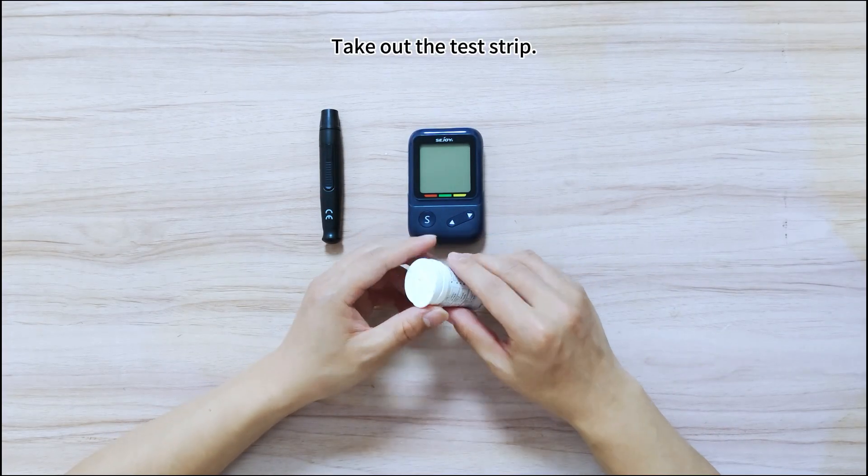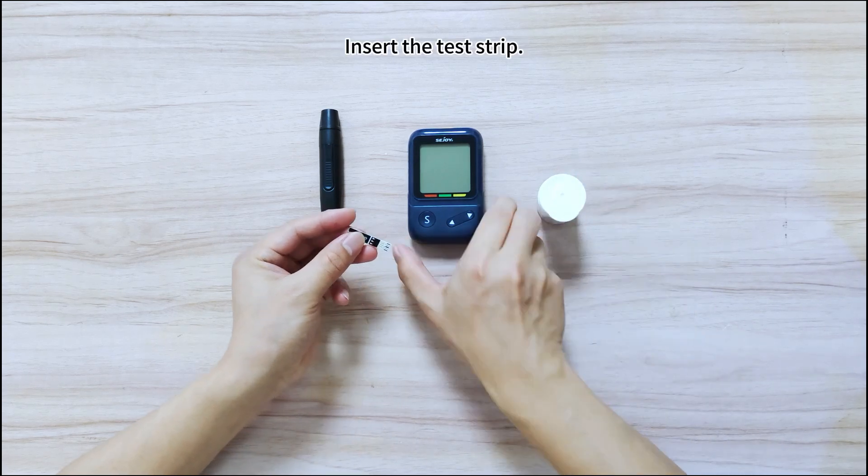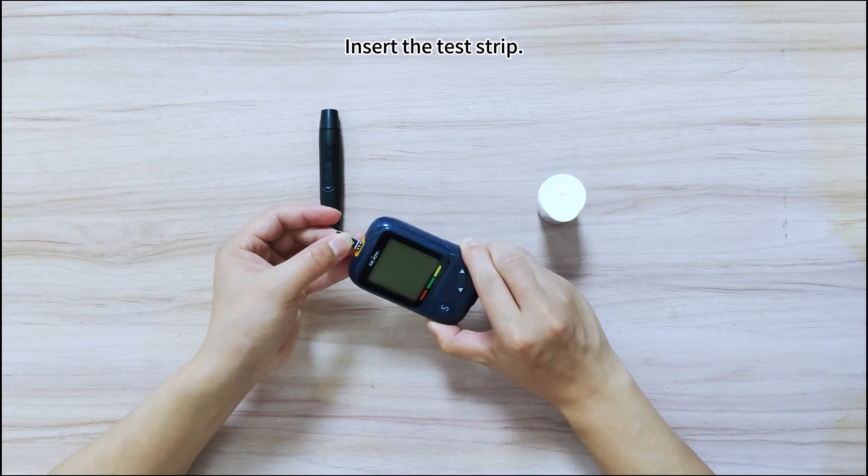Use the test strip immediately after you open the bottle. Insert the test strip and check the flashing mark on the screen.